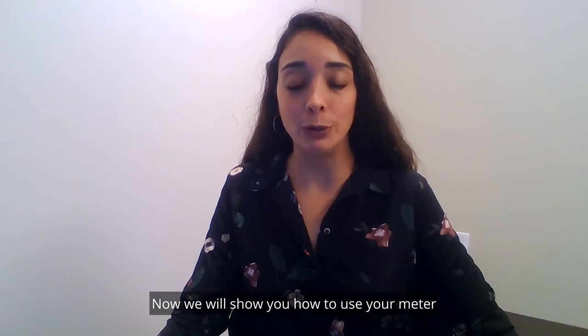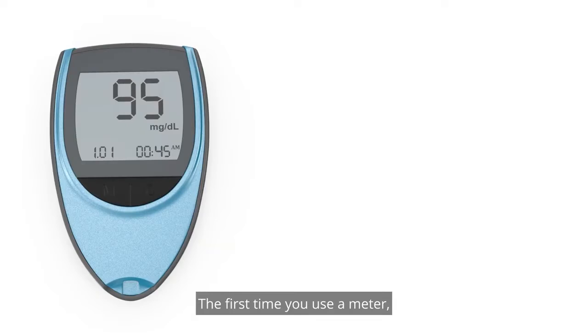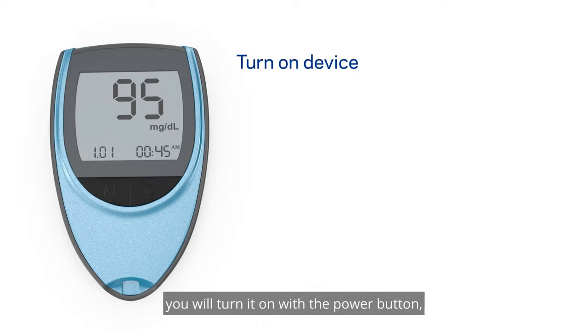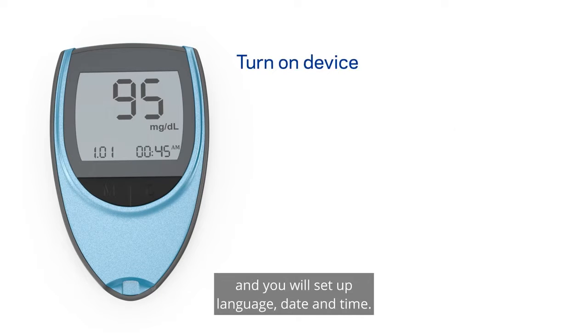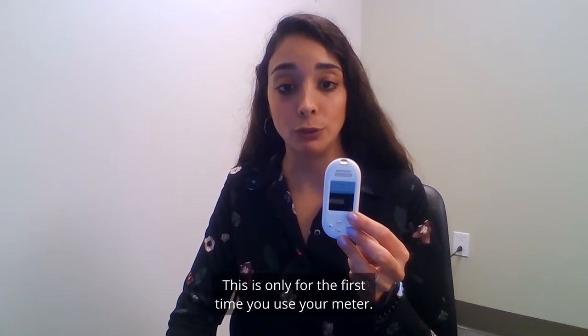Now we will show you how to use your meter to check your blood sugar. The first time you use a meter you will turn it on with the power button and you will set up language, date, and time. For reference you can use the instructions on your box or the manufacturer video. This is only for the first time you use your meter.